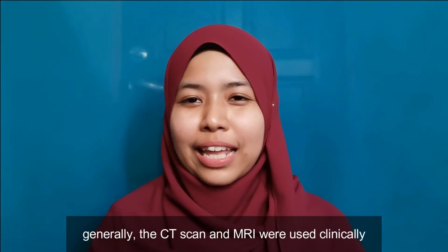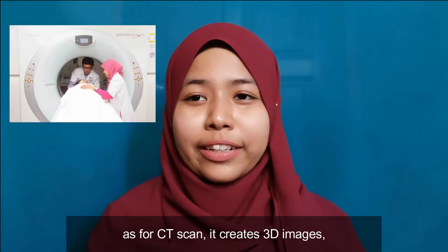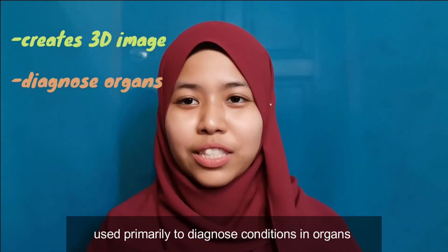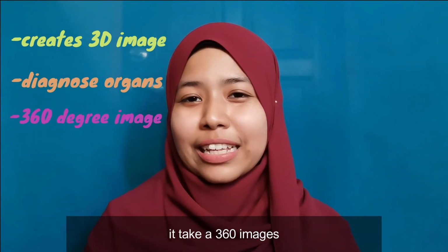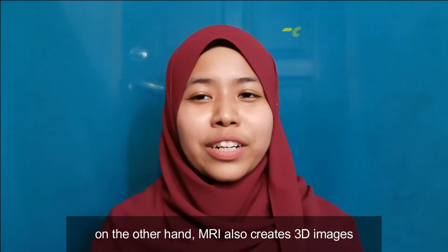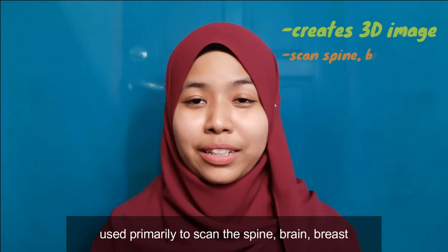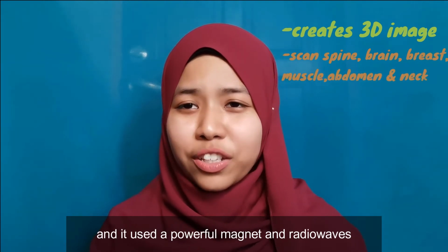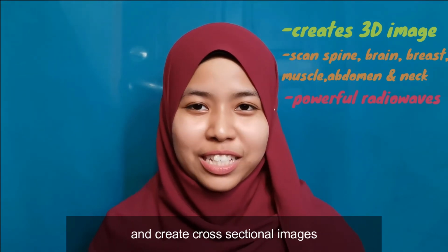Generally, the CT scan and MRI are used clinically in different cases. As for CT scan, it creates a 3D image used primarily to diagnose conditions in organs and soft tissues, more powerful than an X-ray, and it takes 360-degree images. On the other hand, MRI also creates 3D images used primarily to scan the spine, brain, breast, muscles, abdomen, and neck, and it uses a powerful magnet and radio waves to create cross-sectional images.